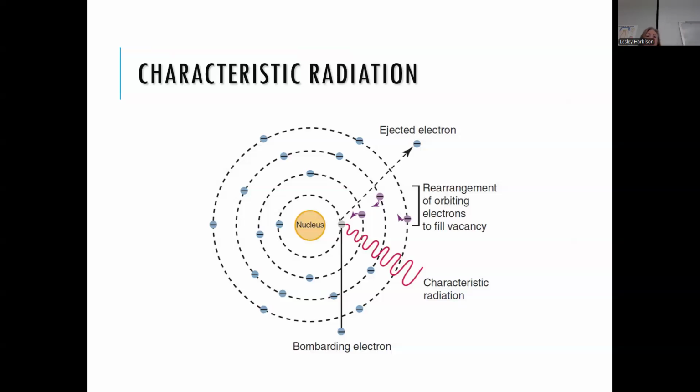Some of the notes here, sometimes I don't always read my notes from year to year, but I do see that I highlighted K-shell electron. So the bombarding electron is done. It's used all of its energy, and it can't go in.